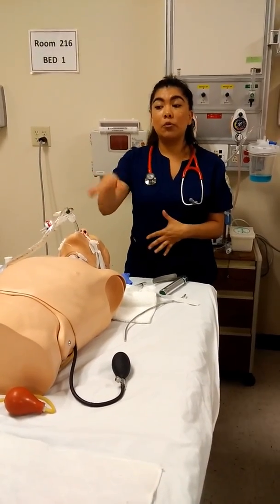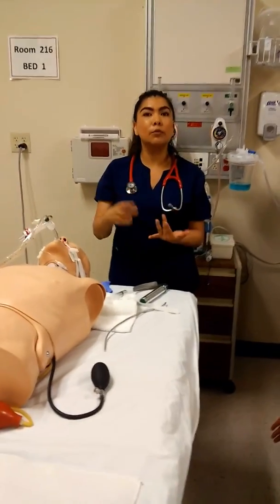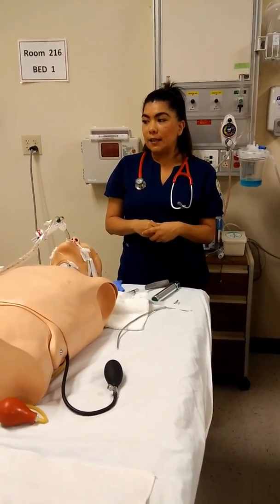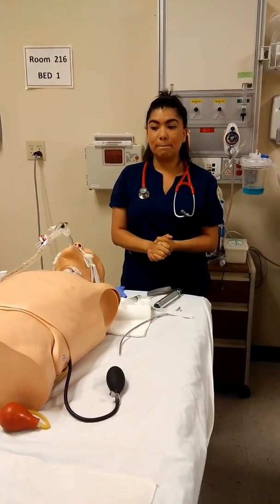And then I would go obtain also the patient's vital signs. Once again, aside from listening to their breath sounds, I would go ahead and check their heart rate, respiratory rate, their saturations. And yeah, so that's the way it is to perform an intubation.